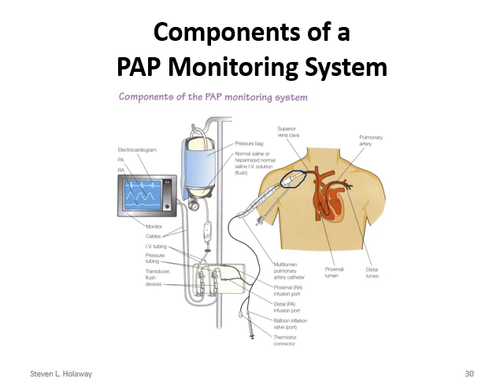It's a large bore IV, and your Swan-Ganz catheter actually threads down through that to get into the site. Most of these will have some type of device where you can actually give IV fluids through here. In CVICU, this is the port they usually will use to give their pressor agents through to their patients.